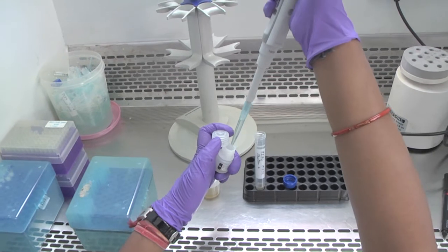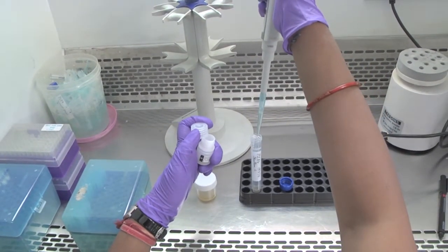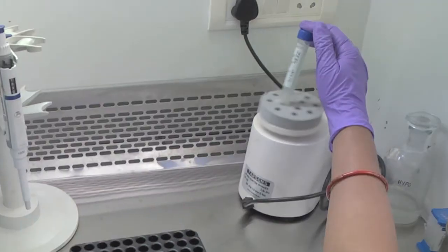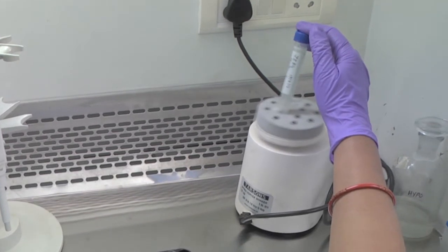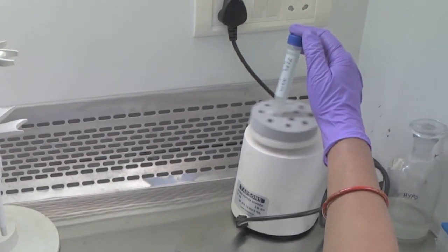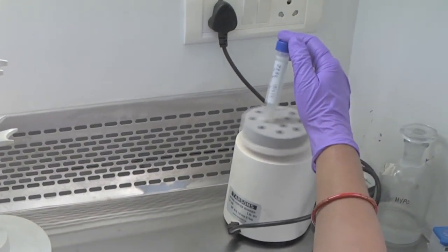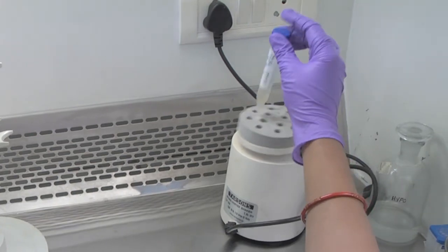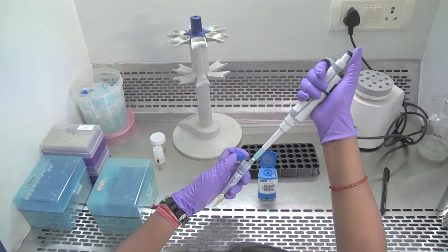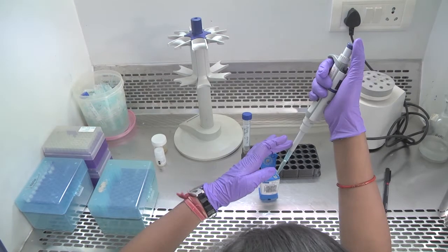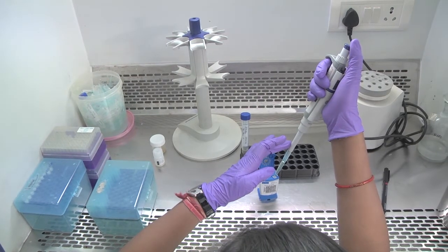The diluent is then mixed with the sample with the help of a pipette. Mix the sample and the diluent well, either manually or with the help of a vortex mixer. Incubate the sample, and after incubation, transfer the sample into the cartridge.